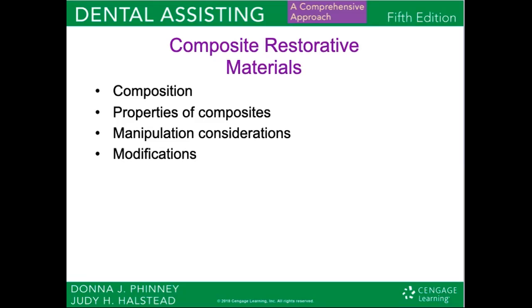Packable composites are the consistency of putty and are highly viscous. They are used in areas that need stronger restorations, such as core buildups, or especially for restorations in the posterior teeth.